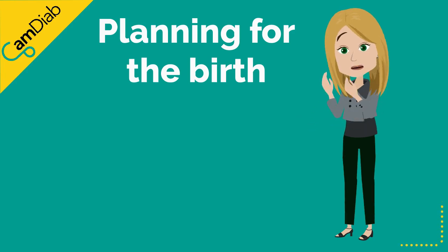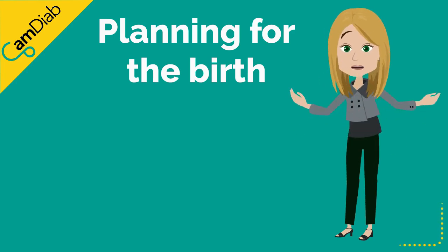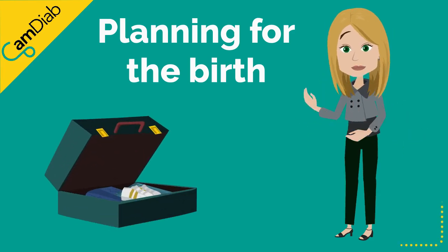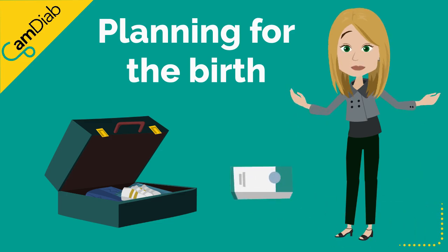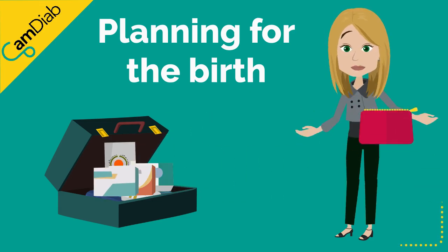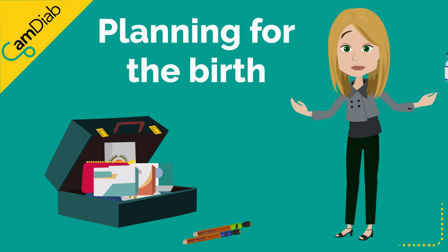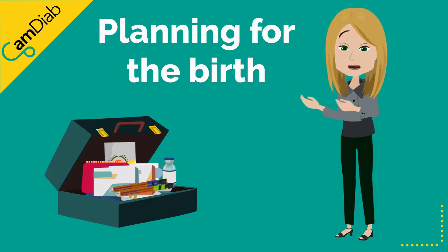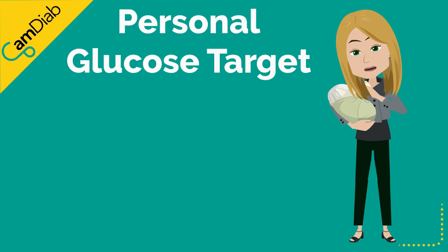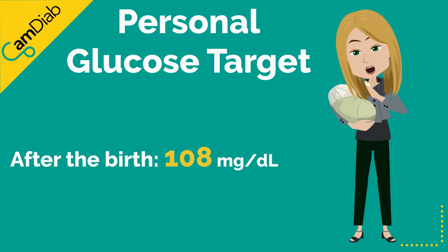Towards the end of pregnancy, it is good to plan the setting changes that need to be made immediately before or after the birth. Don't forget to pack your hospital bag with plenty of spare infusion sets, reservoirs, cannulas, sensors, blood glucose meter and testing strips as well as insulin pens and vials. The personal glucose target needs to be increased to at least 108 milligrams per deciliter across the 24 hours of the day, just before or after the birth.